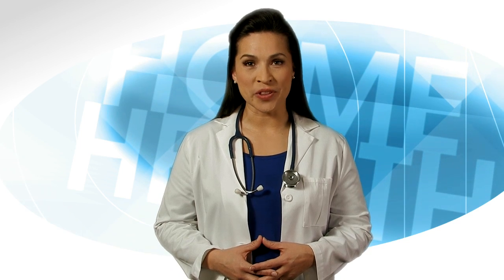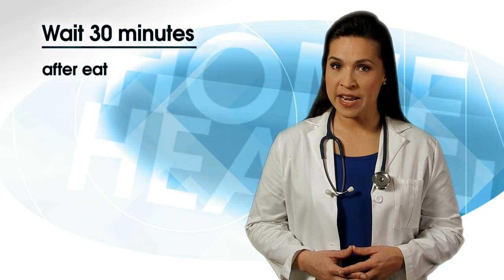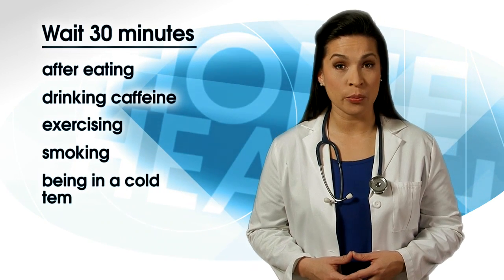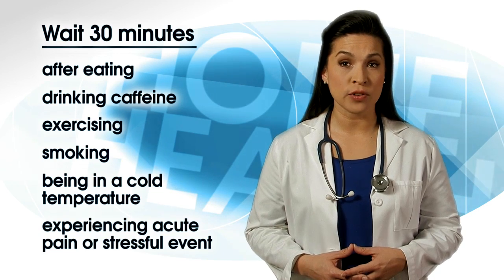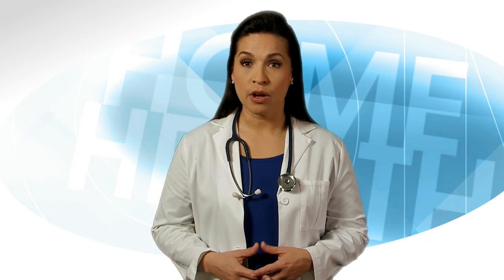Taking your blood pressure is simple with a monitor, but there are many different things that can cause readings to be inaccurate. You should wait at least 30 minutes after eating, drinking caffeine, exercising, smoking, being in a cold temperature, experiencing acute pain, or having a stressful event before you take a blood pressure reading. Also, make sure you recently emptied your bladder. A full bladder can cause a rise in your blood pressure.